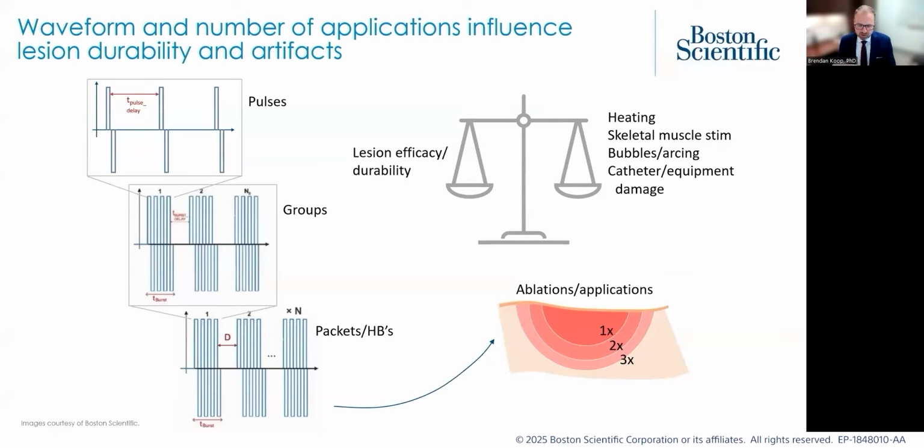It's not necessarily that we're increasing our efficacy. It's that we're being more efficient and we're eliminating the negative effects that we're trying to avoid. And I think FARAPulse, when that research was first going on, did that quite effectively.